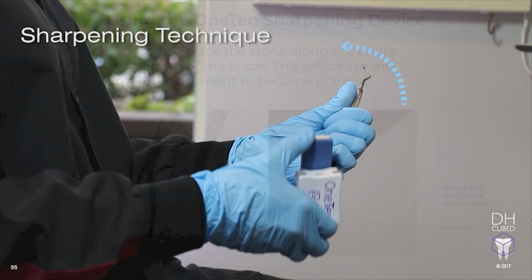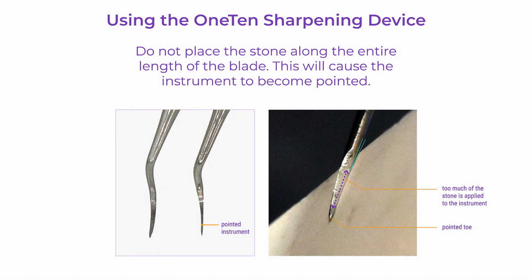Because the sickle has 2 parallel cutting edges that converge at the tip, unlike the Gracie, many people make the mistake of thinking they can apply the stone along the entire cutting edge to sharpen it all at once, not in the recommended 2 to 3 millimeter increments from the terminal shank to the tip. When the stone is applied to the entire cutting edge at one time, the instrument will become more pointed and prematurely thin. This can lead to the tip breaking off in the sulcus. And it will require the hygienist to work harder to adapt the instrument to the tooth because the original design has been altered.